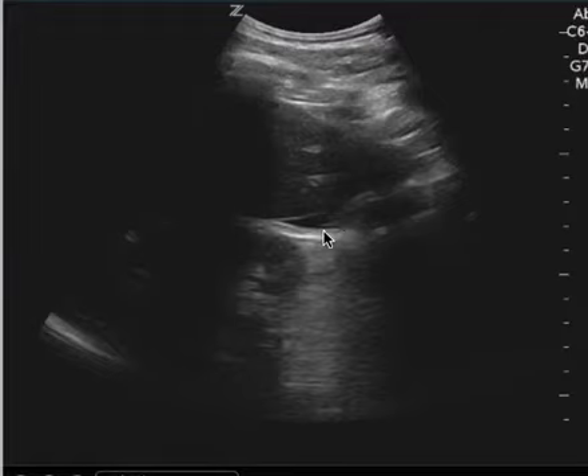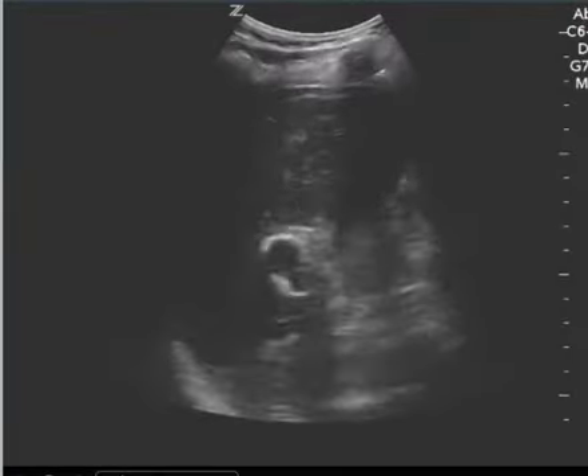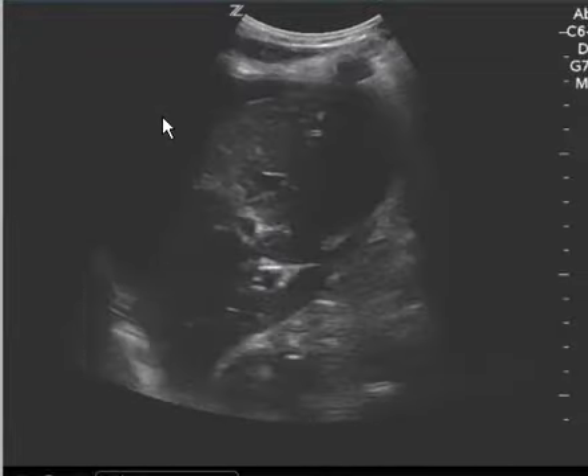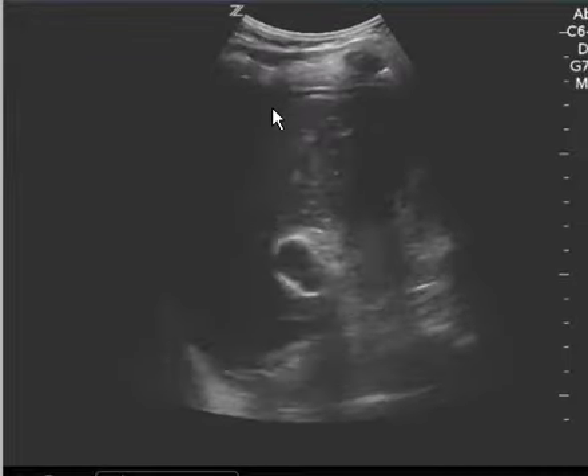This should not be there. This is not gallbladder. This is not a false positive. This is abnormal — this is free fluid. In addition, you have really good images of the right upper quadrant where you can actually see free fluid in the space between the liver and the diaphragm. This black anechoic finding is definitely free fluid.